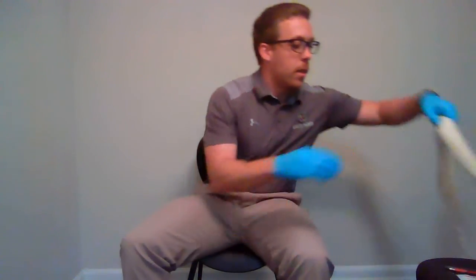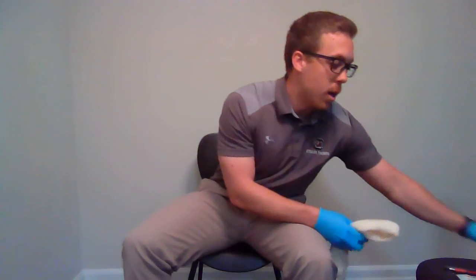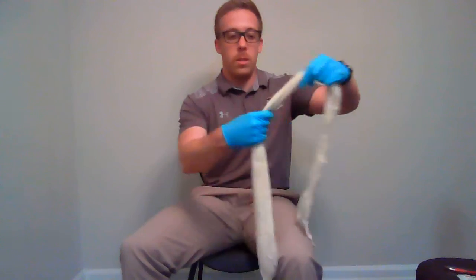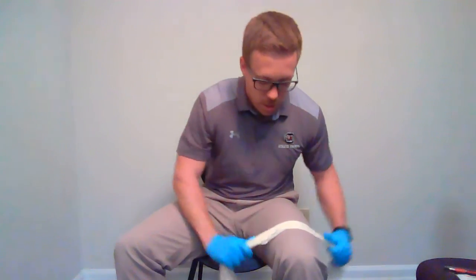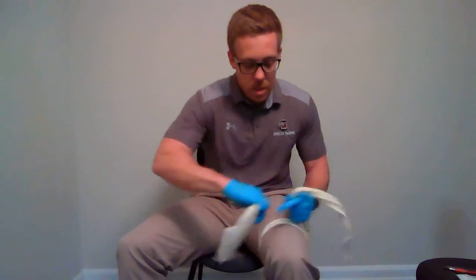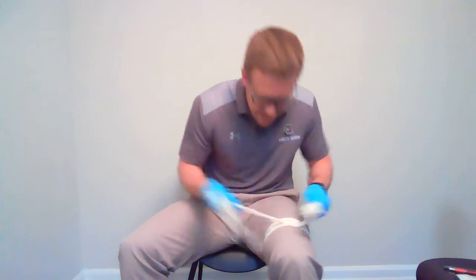When applying a tourniquet, pull out a triangular bandage from your bag — the kind used for slings. Roll it up so it's about 2 inches wide. Place it above the wound about 2 inches, lay it on top, wrap it around as tight as you can, and tie a single overhand knot as tight as possible.